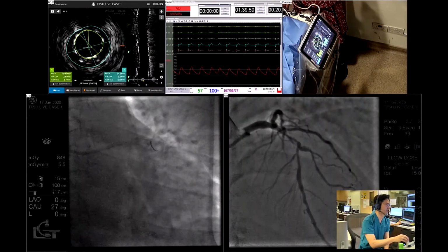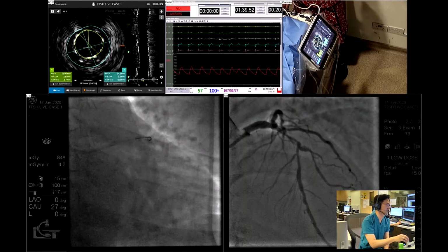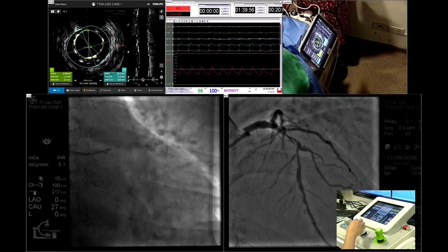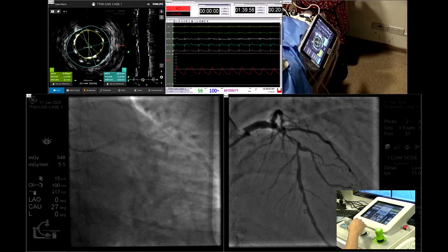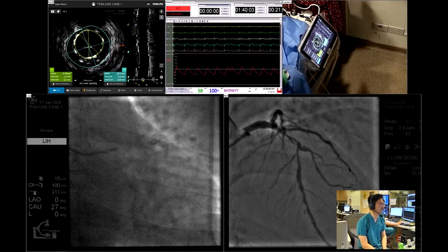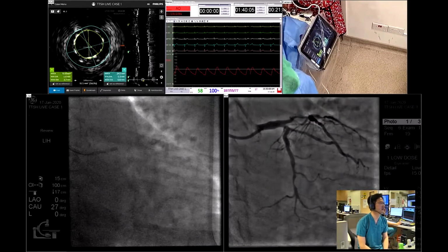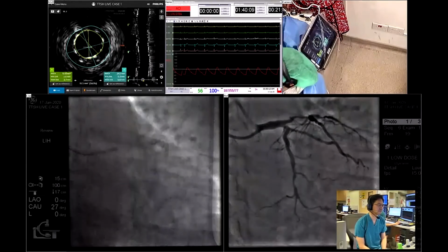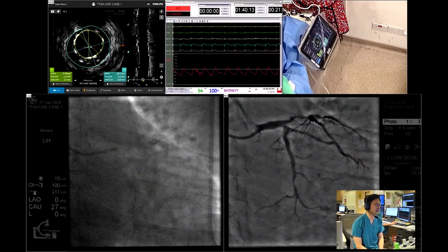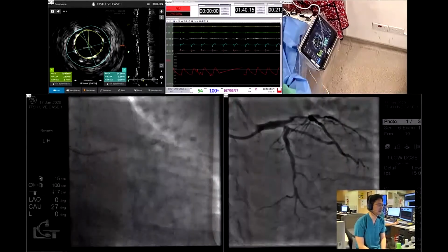I probably will respect the size of the stent because it's a very proximal stent, and I feel a little bit uncomfortable blowing up to 4.0, knowing that the expansion limit is 3.5. Okay, can I? Pressure is better. Can we give a bit of nitrate, 50? Yeah, 50 nitro, and then once you've done that, maybe we'll put the iFR wire back down.